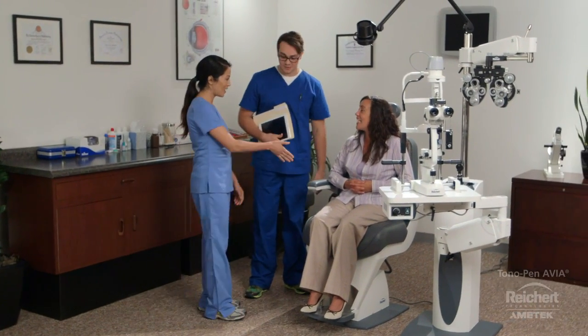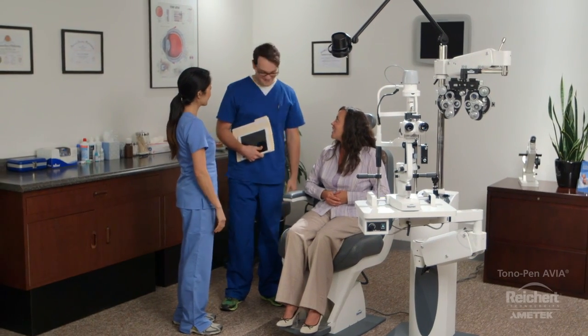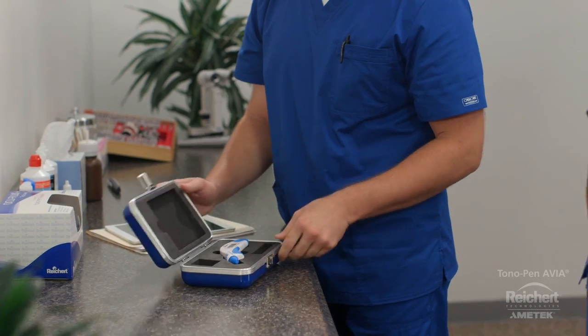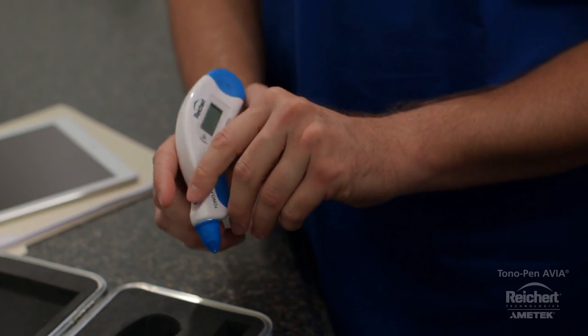Amy is having first day jitters. She's just started at Dr. Green's practice, getting on-the-job training, and she's feeling a bit overwhelmed. However, her nerves quickly begin to subside as Eric starts to demonstrate how to use Riker's Tonopan Avia.